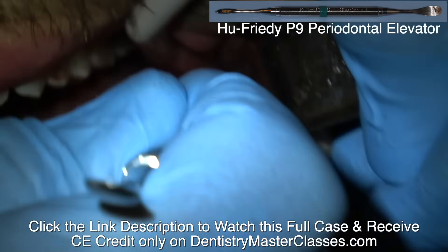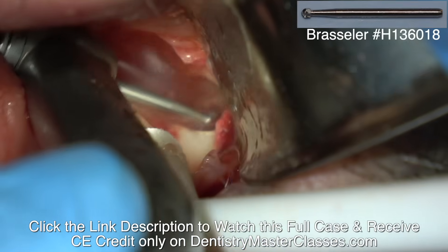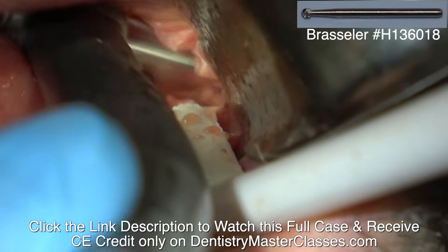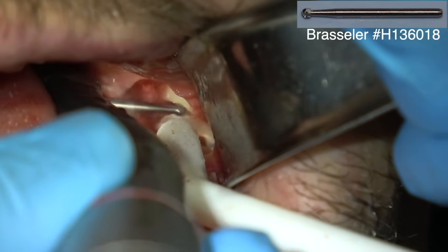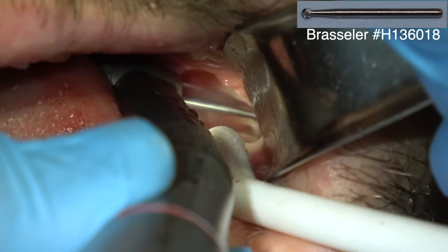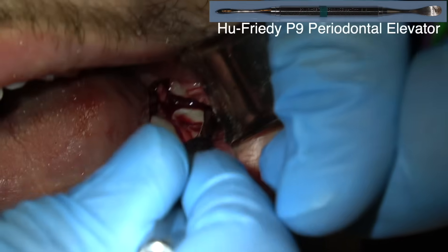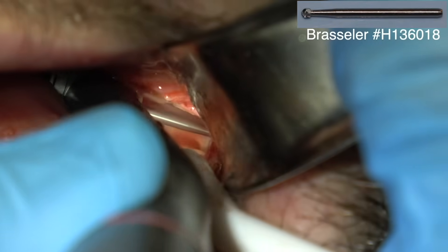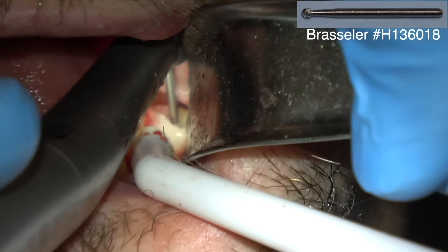I'm going a little further up the ramus just to create a big flap so I've got access. You can see the distal piece is elevating, but there's so much for this piece to bump into — the distal of the socket and the distal of the mesial coronal part — so I'm having to remove more tooth structure. Here are the two pieces, and I'm trying to move the mesial piece too, just seeing which one will come out easier. Once I've got the space, I can either move the mesial piece into the distal root-crown space or move the distal piece into the mesial root-crown space. Ideally you'd rather remove the distal root and distal coronal part first.